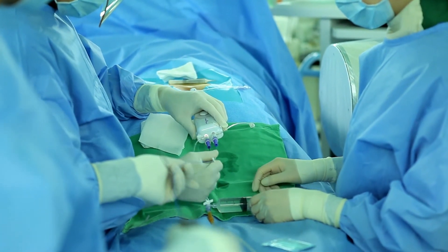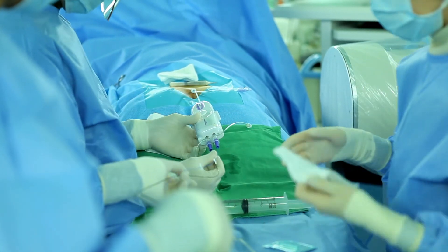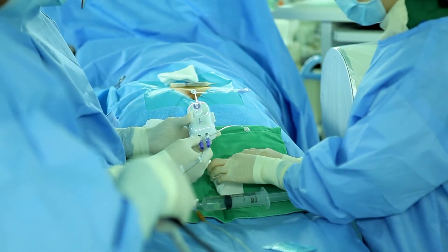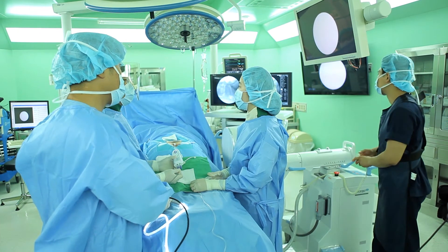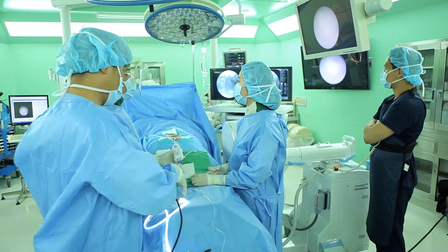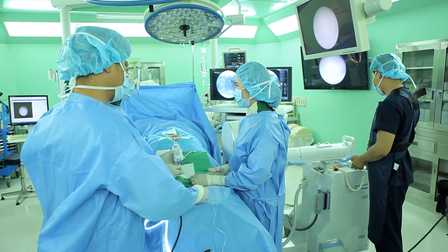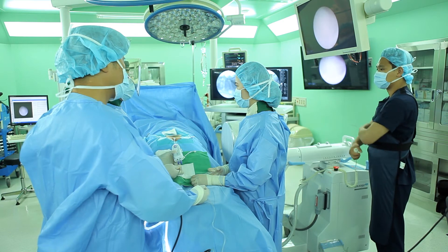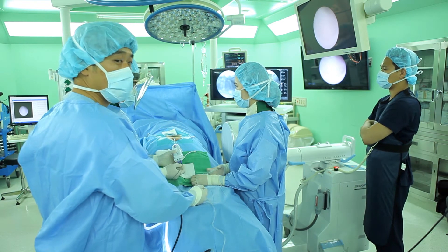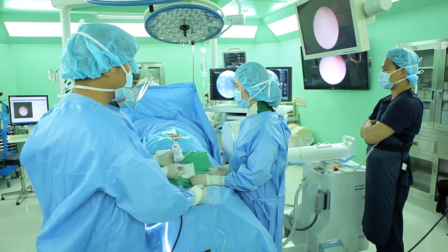Now it's time to insert the endoscopic cable through the catheter to secure a clear view. There are some cases where you can't see clearly through the endoscopic cable at the beginning of the procedure. In such a situation, how can you solve this problem?